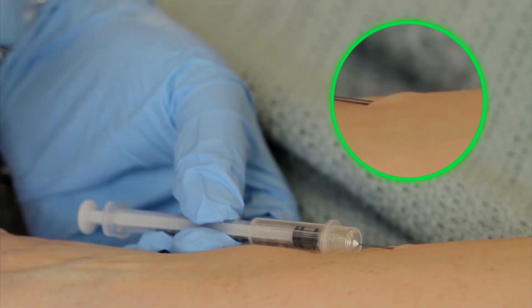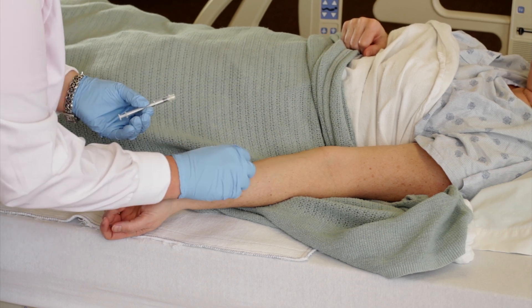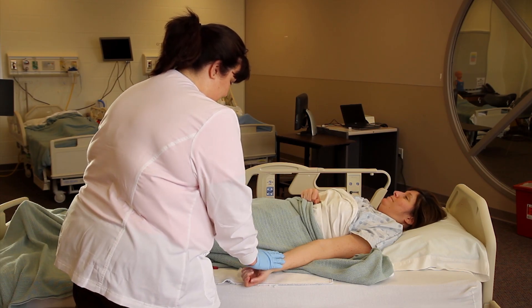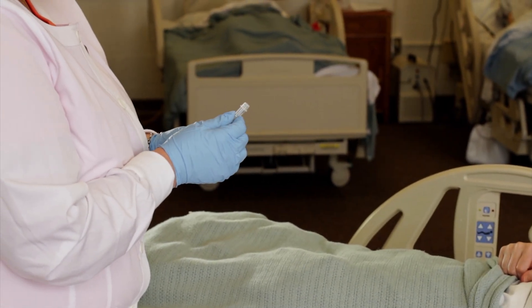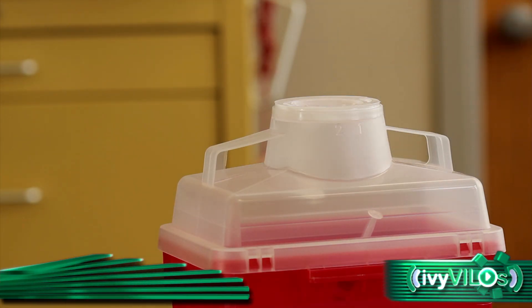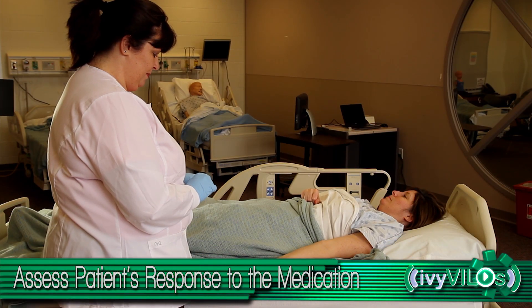Withdraw the needle smoothly at the same angle of insertion. Apply dry gauze with gentle pressure. Do not massage the site. Do not recap the used needle. Engage the safety shield or needle guard. Discard needle and syringe into the appropriate receptacle. Assess patient's response to medication.